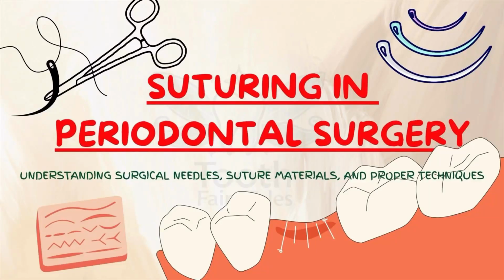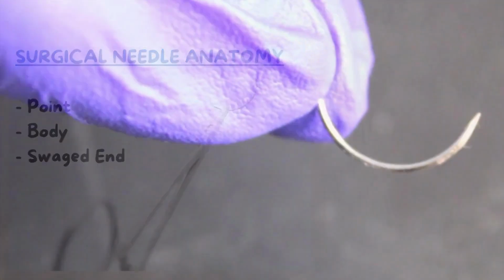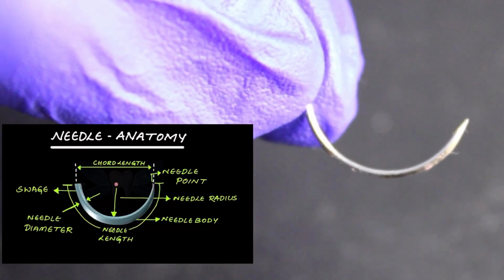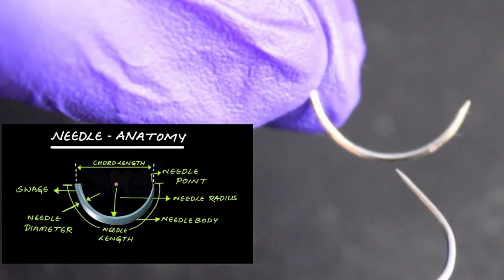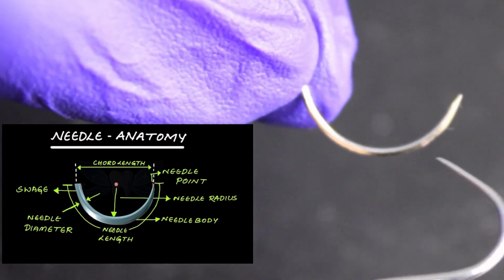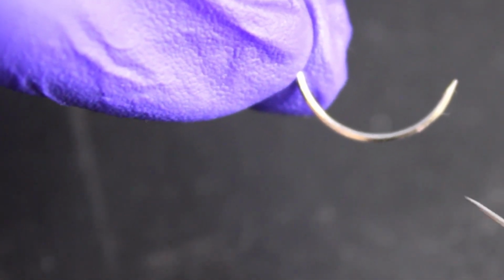In this video, we are going to talk about suturing in periodontal surgery. So let us begin by talking about surgical needle anatomy. Now, a surgical needle has a basic design that is made up of three main parts. Understanding these is crucial because each part plays a specific role during suturing.